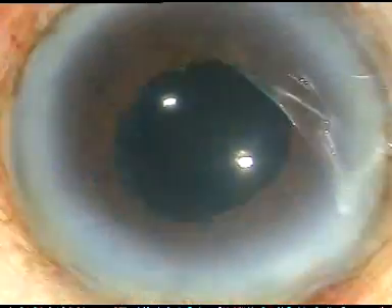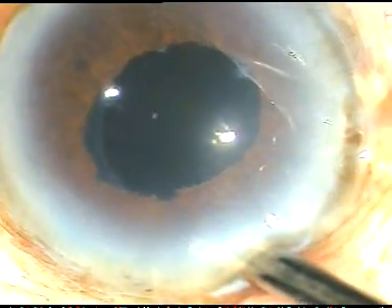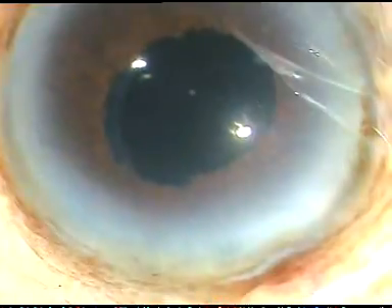See how beautiful it looks, because it has been completed so patiently and so nicely. I just have to hydrate from the main incision and conclude the case. Hope this video will help you in developing your surgical skills. Thank you very much for your attention.